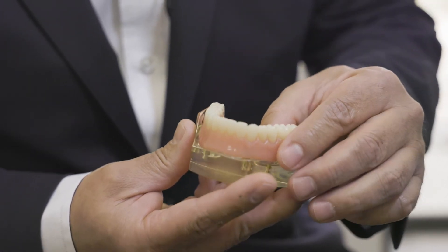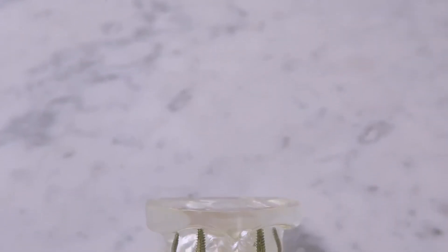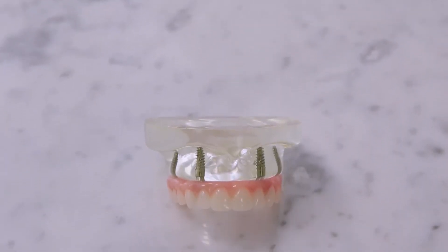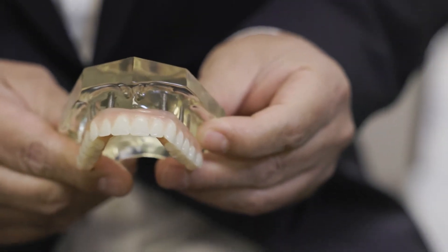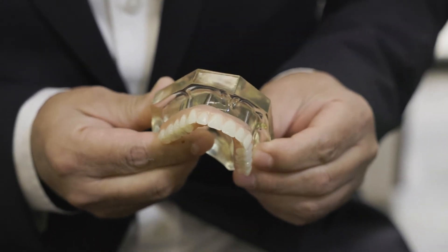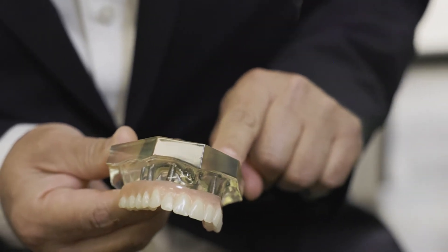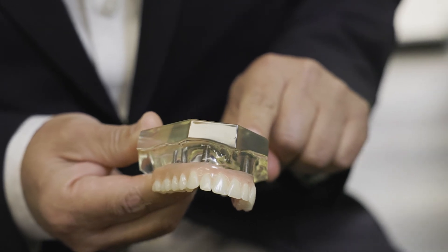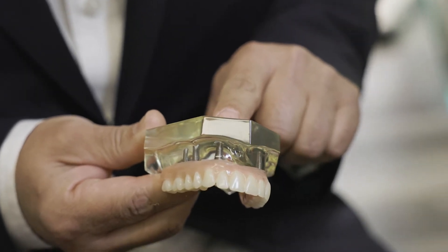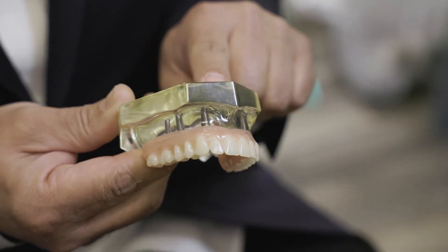This really increases the patient's bite force. From the snap-on teeth, we move more towards a fixed bridge option — we call that the All-On-X. With this option, we have a minimum of four implants, and we usually use four to six implants.